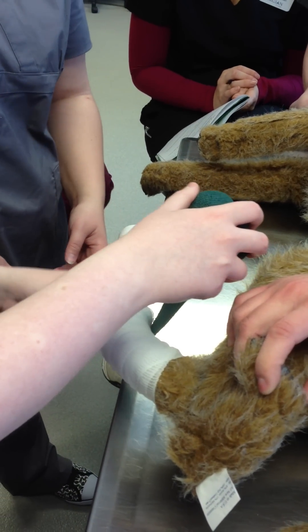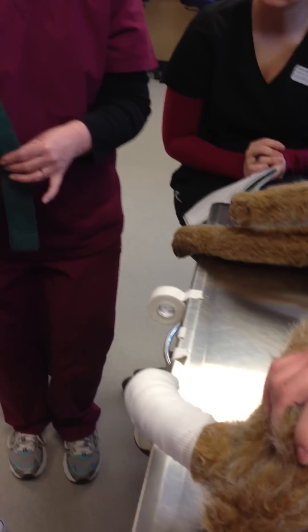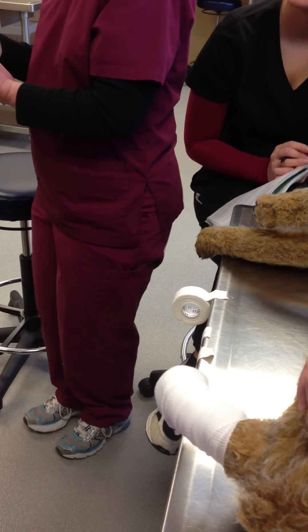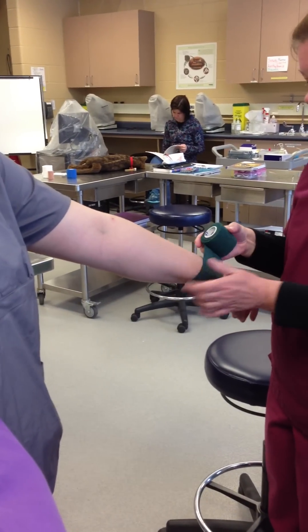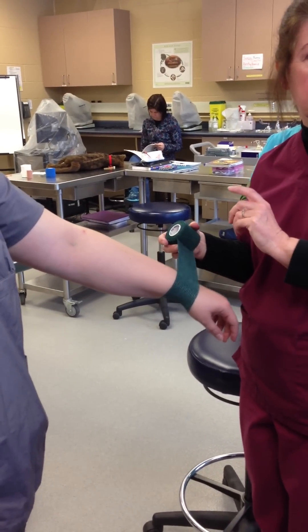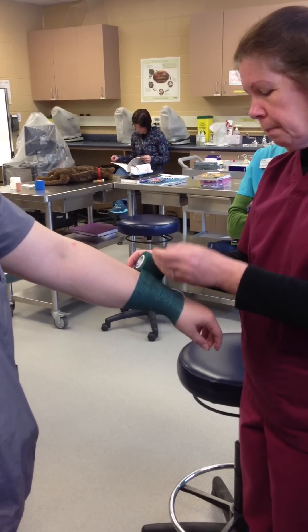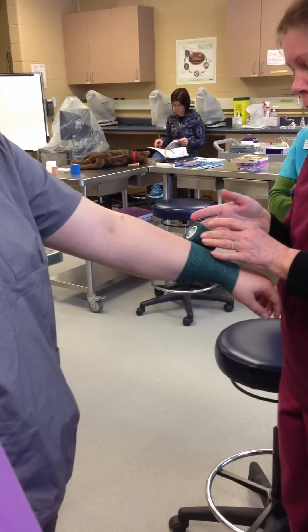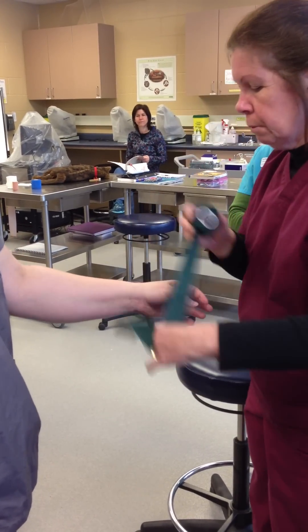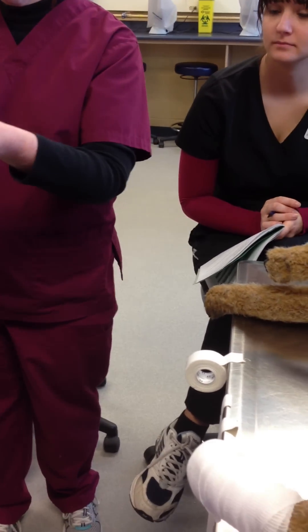Does it matter which direction you roll? We want to try and roll off the bandage, going around 360 degrees on your first one. But it doesn't matter if you're rolling clockwise or counterclockwise. The only time I'm aware of when that matters is for stable bandages on horses — that's about avoiding pressure on the suspensory ligaments and tendons. In small animals, I'm not aware of that making any difference. Whether you go clockwise or counterclockwise, I think it depends on whether you're right- or left-handed.